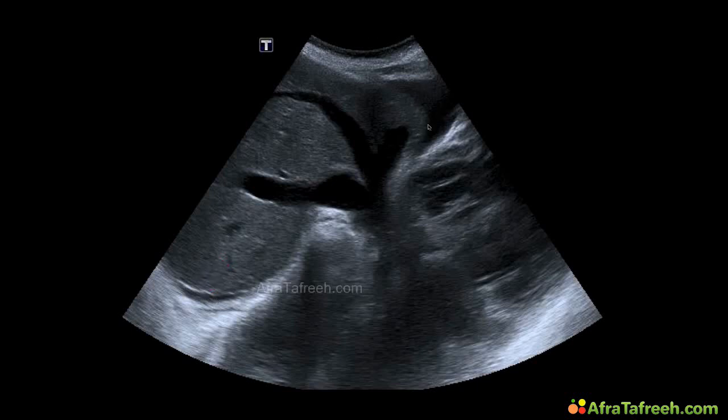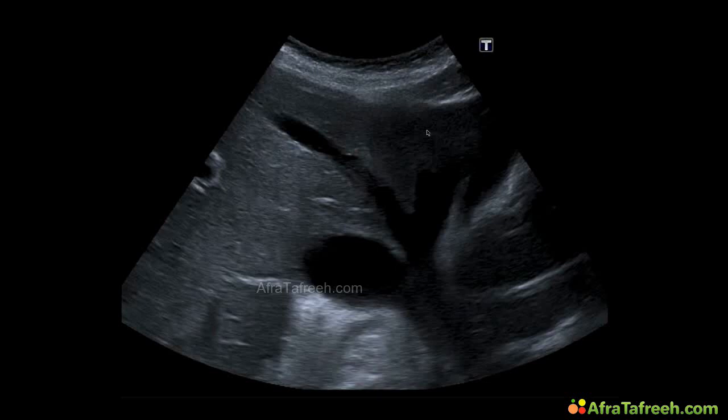The same in this area over here on the right side of the picture, even a little larger field of free fluid, which points to ascites. In this picture over here, again, we see the widened confluence of the liver veins, very easily seen.